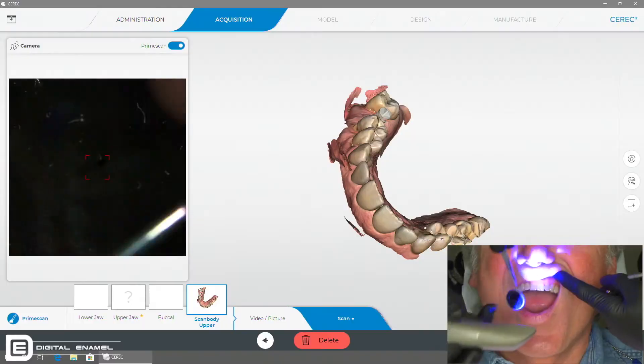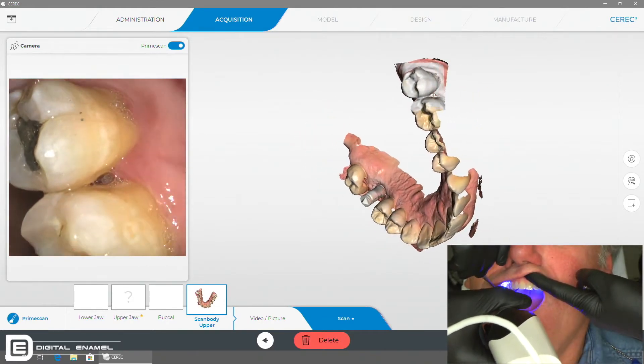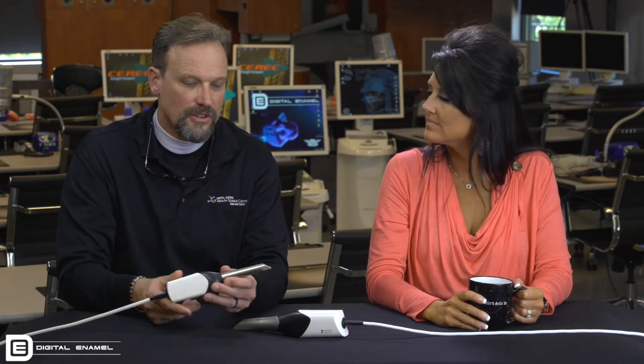By the time the data gets through the camera, it's already gone through what you could call a digital wash process. So when you're seeing the model being formed on the screen, it's already almost complete. That's the huge difference — with the Omnicam, all the data goes to the computer first, so you're seeing a lot of noise. Omnicam owners know what I'm talking about: you see all the pixels around and think, why did this get so weird? With the PrimeScan, the initial models are already better — they're so clean.